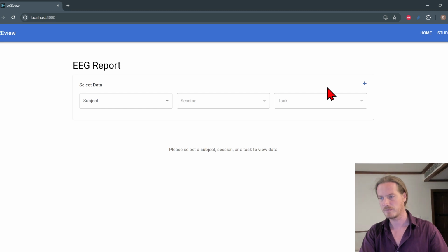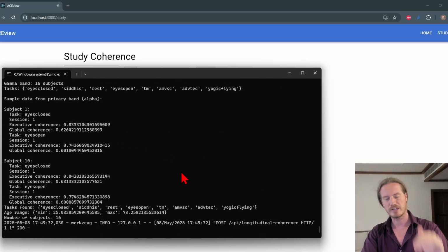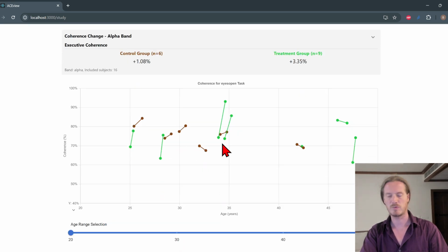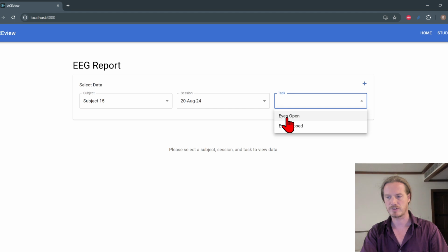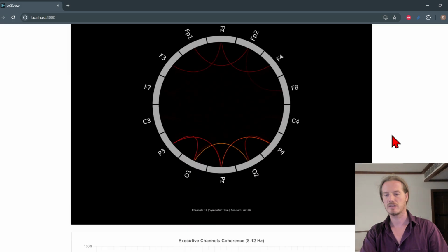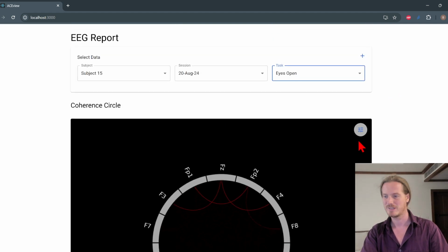in the other video. And so basically when I open the study, this program in the back end and in the front end, it loads all of those little H5 files, and then we can skip through it and see what is happening there. And when we go to the report view, then it does a similar thing, but on an individualized basis. And we can, so we've seen this, but there's some more features here that I haven't shown in the other video.